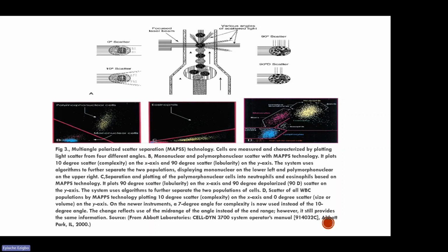So this is the diagram showing the optical laser system. When you read this right up here, you can find out how these cells scatter, this population of cells, this population of cells. It also sorts out this population of cells, and then you can see at the end of the day how the cells are sorted out, and this population that are here, they pick it up as being the same population of cells and are able to name it.